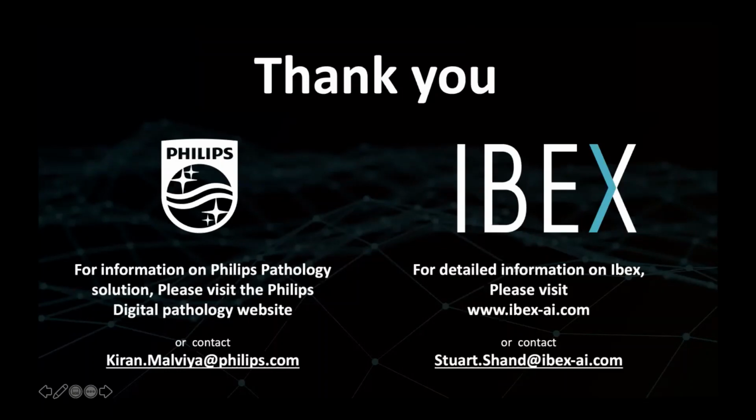Well, they can change. Regrettably, we are not there yet because we're changing our LIS system, so we do not have the capability of integration as of now. But my dream is that we will get a full integration, as Delphine has described. Once the tissue is scanned and the algorithm is going over it, it will order special stains, IHCs or others. The slides will come to us, and the report will already be half ready, such as tumor lengths, tissue lengths, the slides, the stains that were ordered, the diagnosis, the Gleasons, and so on. The only thing left for us is to change parts of the report if they were not filled in correctly by the algorithm.